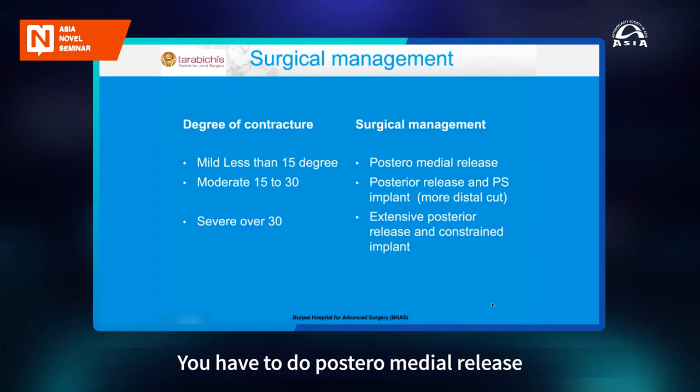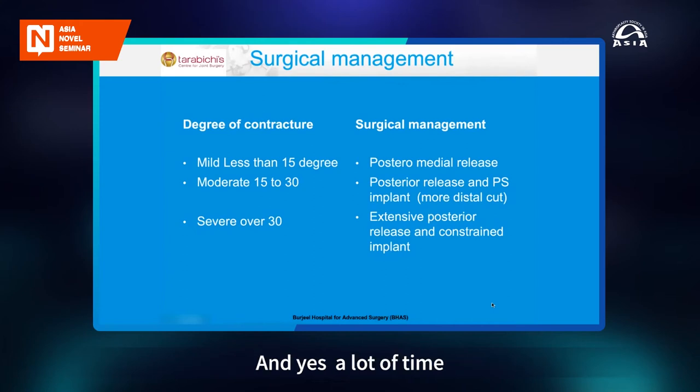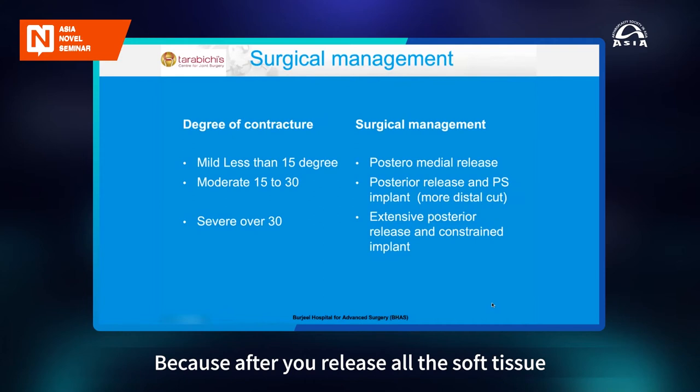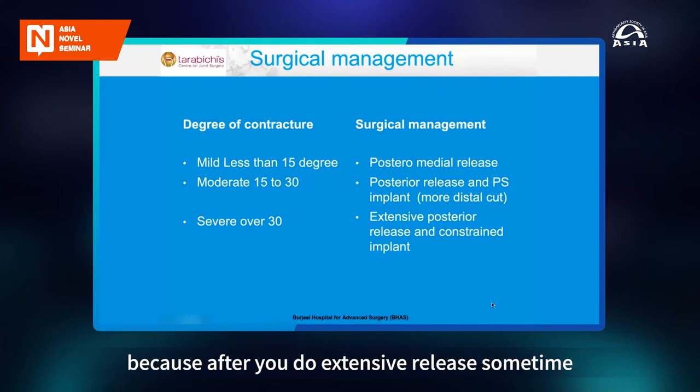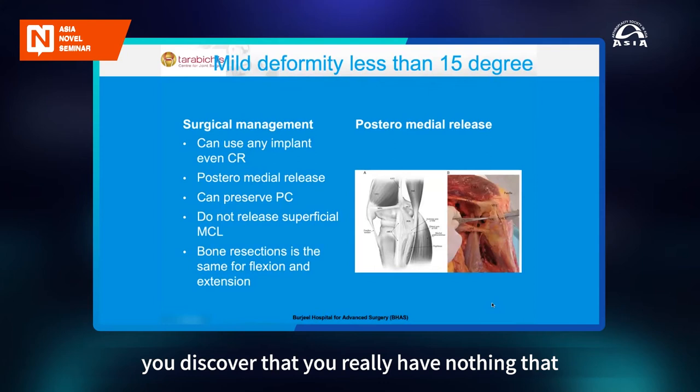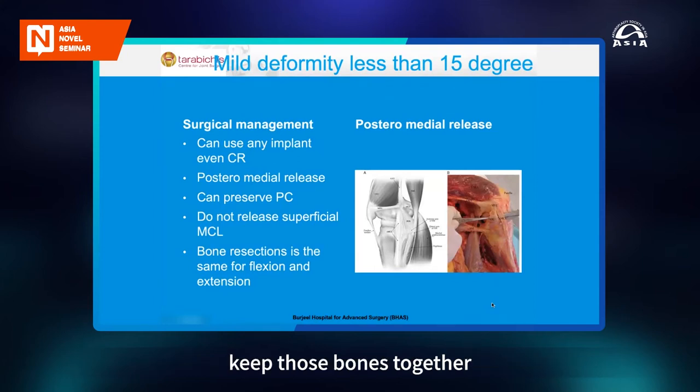You have to do posteromedial corner release, and you have to do also some tricks, and you have to excise all the scar tissue, and yes, a lot of times you have to use a constrained knee, because after you release all the soft tissue, your knee is practically going to be unstable. So be aware of those severe flexion contractures. If you have a severe flexion contracture, please have your CCK ready or even a rotating hinge, because after you do extensive release, sometimes you discover that you really have nothing that keeps those bones together.